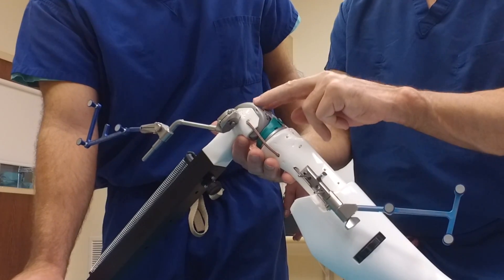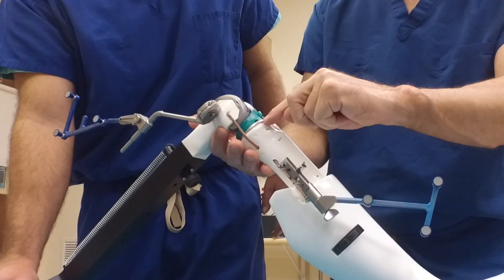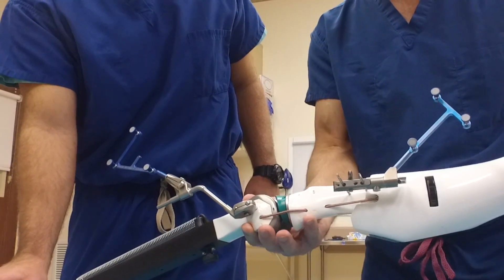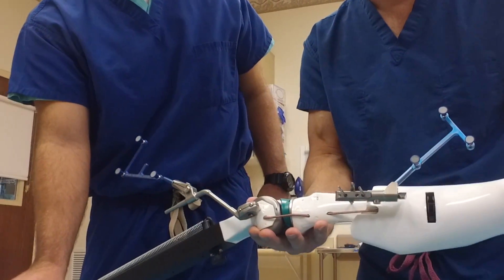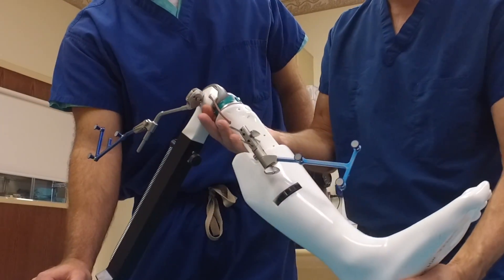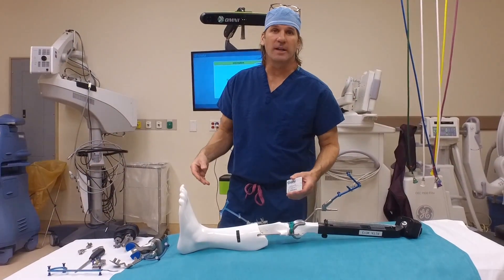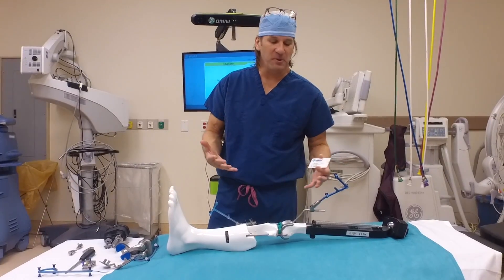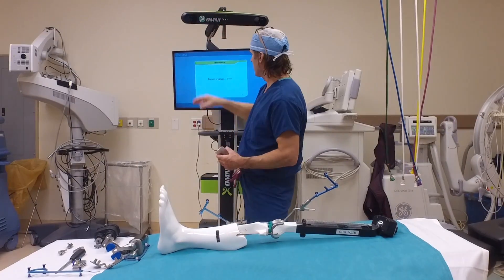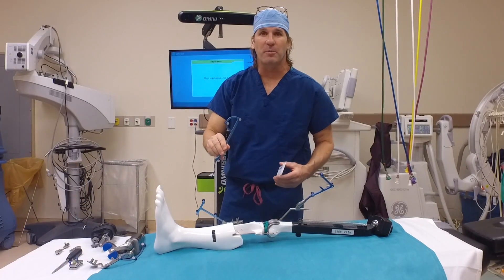This is what it would look like when we've put the actual final components in — we put in our trial tibial tray, the polyethylene, and the femoral component. We run it through that motion, look on the computer screen, and see if that's accomplishing just what we wanted. Are our gaps balanced? Is that knee happy? Do we have just a little bit of play but not too much? That was the nuts and bolts of how we use this robotic arm system. We've got the sensors up here, the main computer, and it talks to these different pointers and sensors through the whole process.